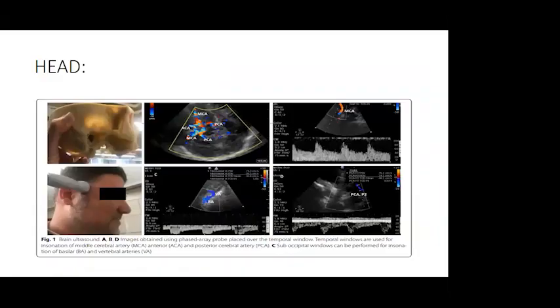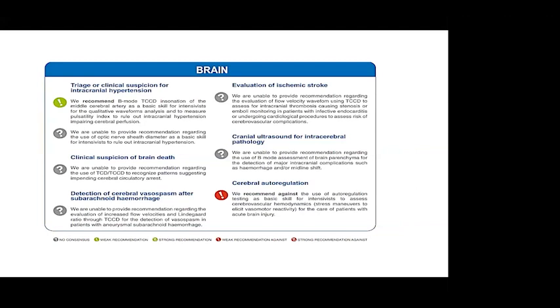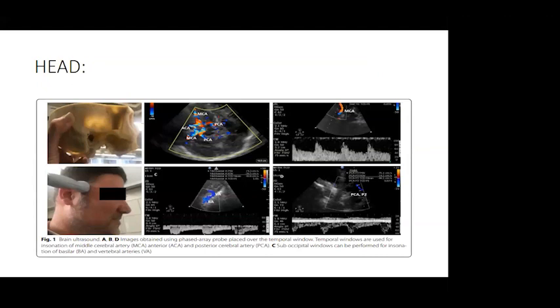Just starting with the ultrasound, there are around 74 recommendations. I cannot go into all of this. I'll try to summarize most of them. Starting from the transcranial Doppler ultrasound, we all know there are 3 areas where we can have a window for the brain. One is the temporal fossa, the thinnest part of the bone, where we can access the brain parenchyma from. We can use the orbital window for the optic nerve sheath diameter, keeping the probe on the eyeball, and we have the suboccipital approach.